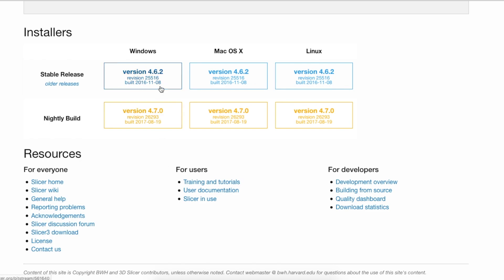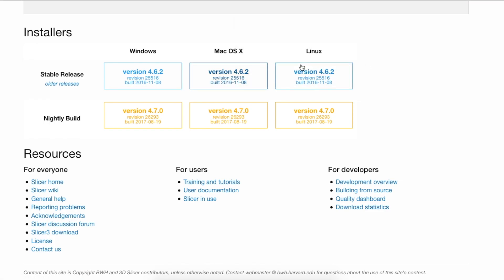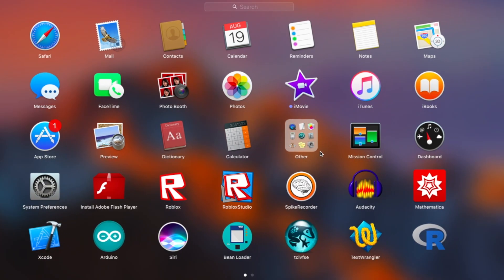Here you can see you have a stable release and a nightly build, with Windows, Mac OSX, and Linux versions. Download it for whichever operating system you have, and always go with the stable release because the nightly build means they're constantly changing things. I have a Mac so I would choose the stable release Mac version.